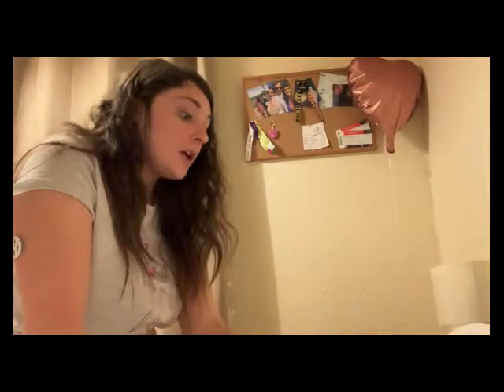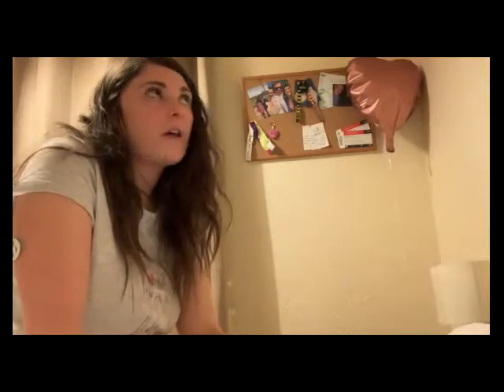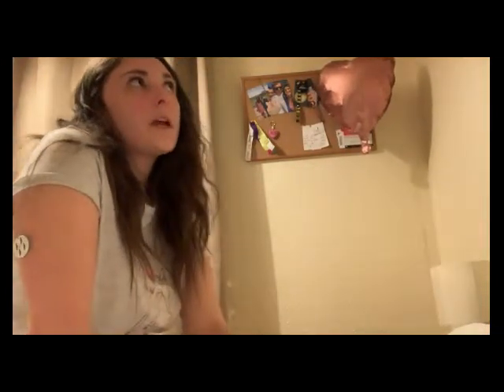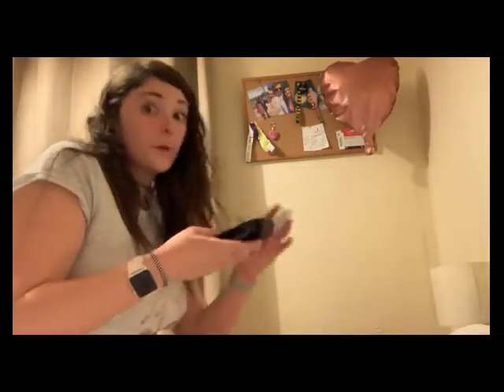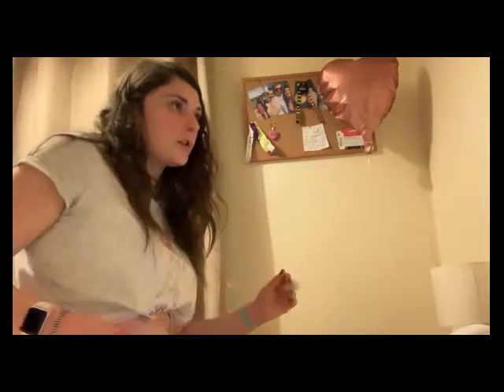But yeah, you have to scan with your reader first, and then within the hour you have to scan it with your phone. Otherwise, if you miss that hour out or you scan it with your phone first, you won't be able to pair your reader, or if you miss the hour you won't be able to use your phone. So you have to do it in that order for them both to work. Anyway, I'll stop babbling on, which is what I do best.